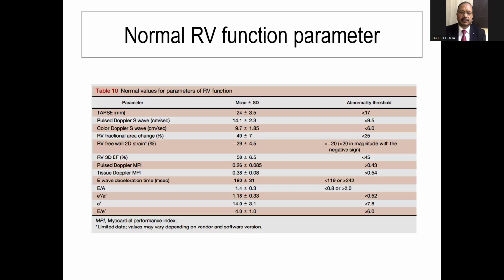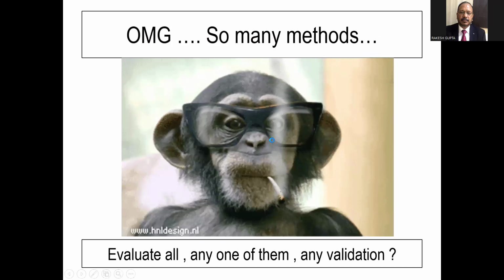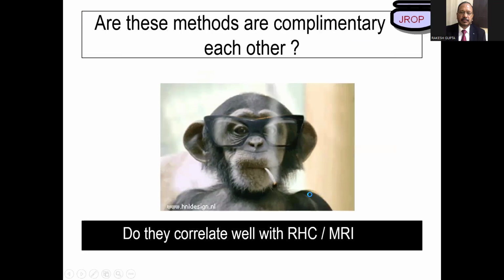You have cut down my slides significantly just to keep it basic, and that's what I always say. There are so many methods, so what do we do in this session? How do we really go about this method? Do they correlate well with right heart catheterization or MRI? Are these methods complementary to each other?